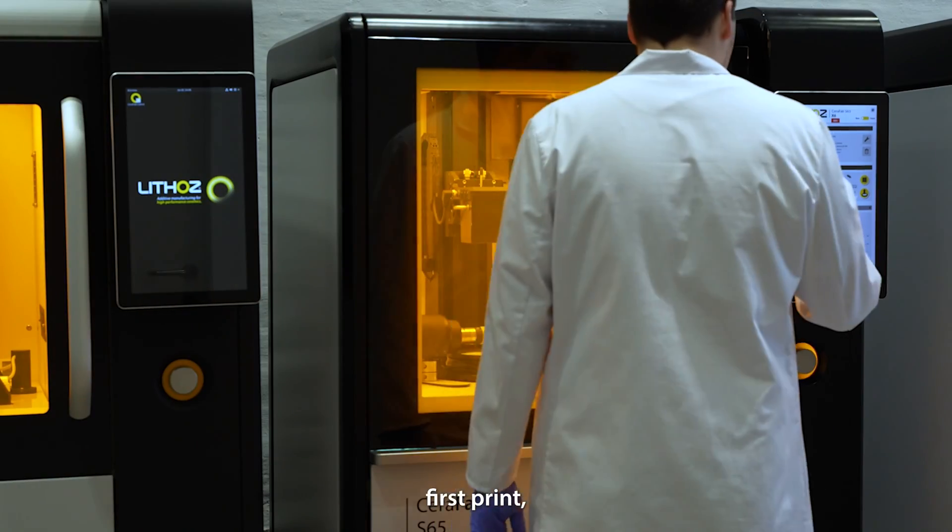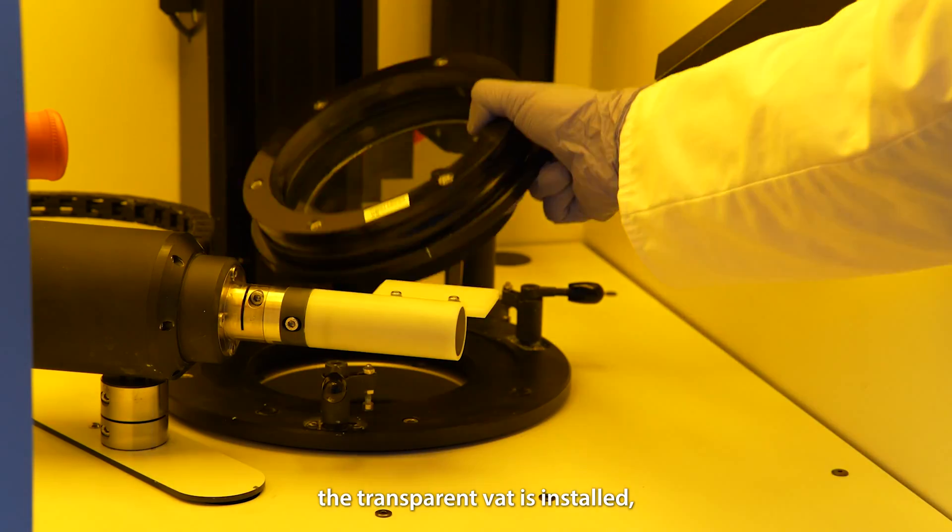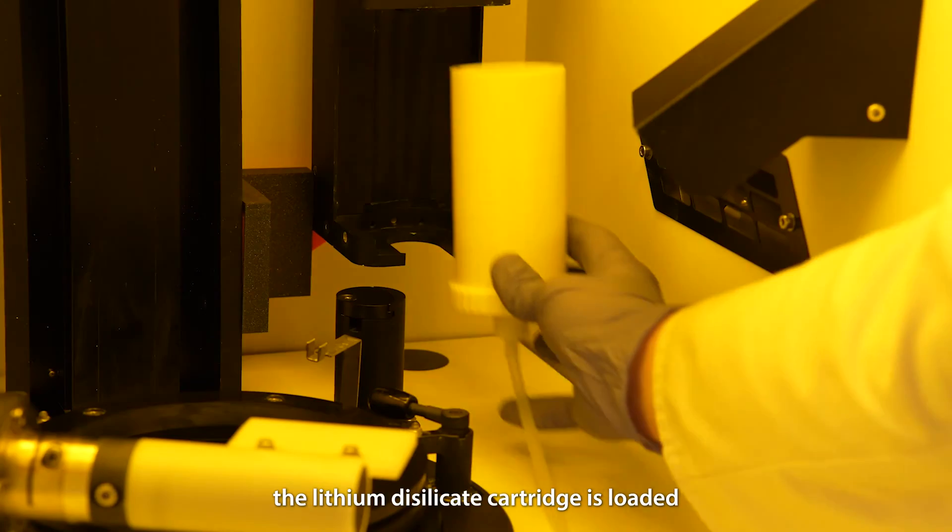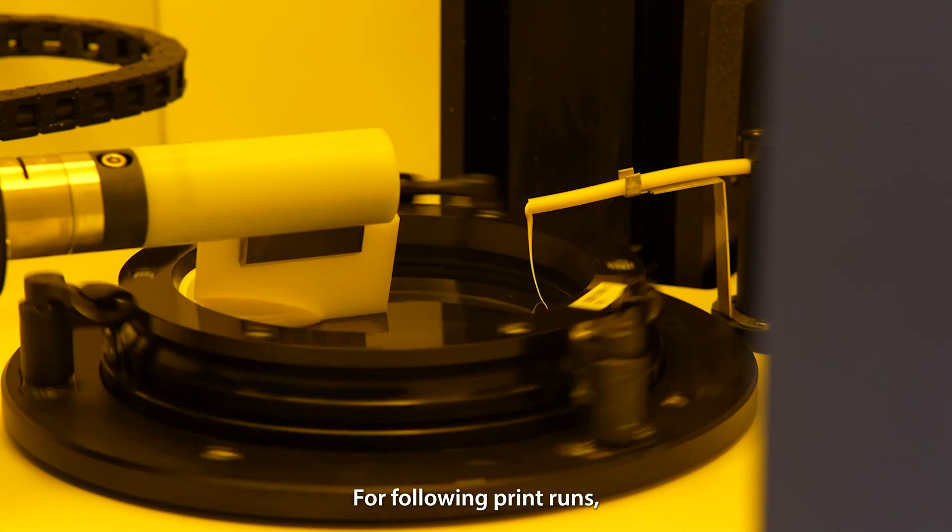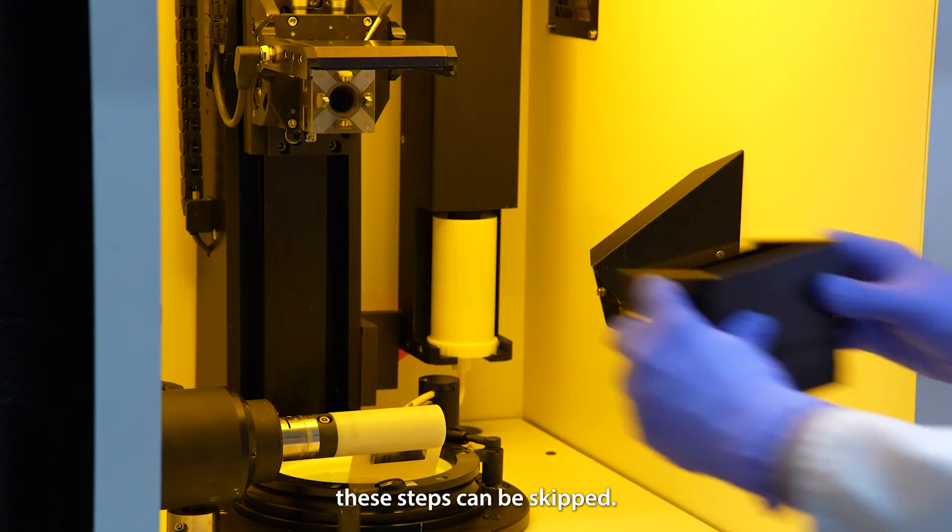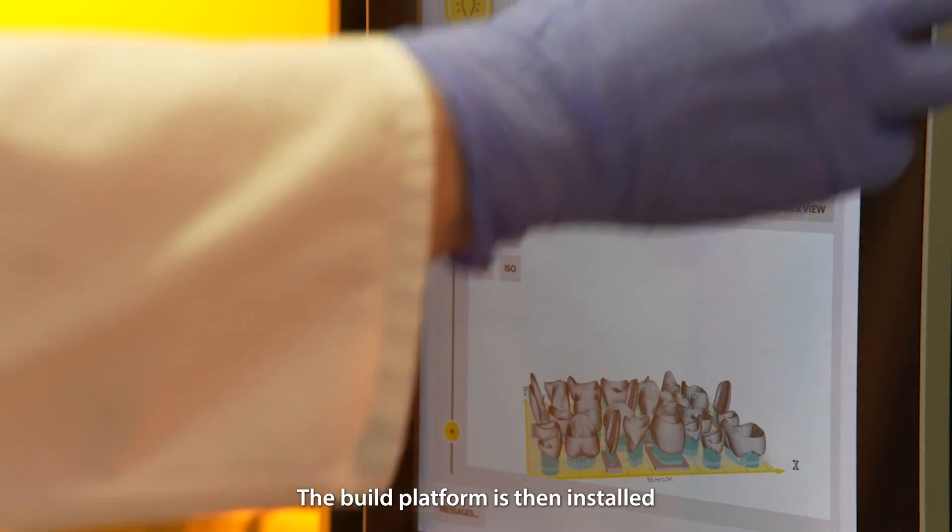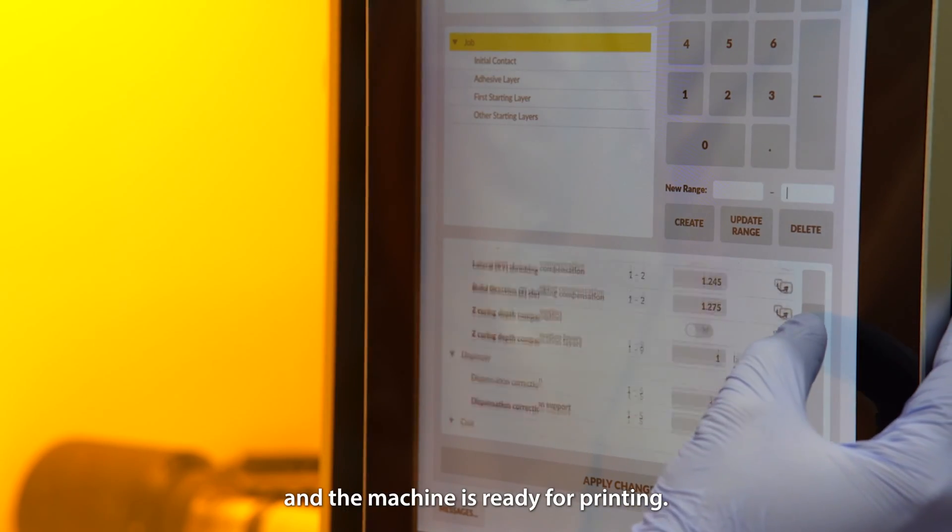To start the first print, the transparent vat is installed, the lithium disilicate cartridge is loaded and a layer of slurry is coated onto the vat. For following print runs these steps can be skipped. The build platform is then installed and the machine is ready for printing.